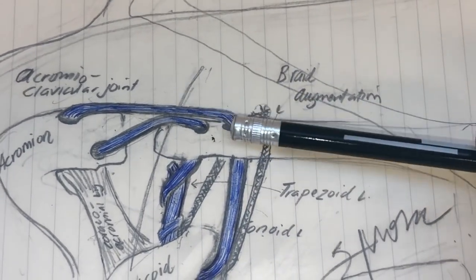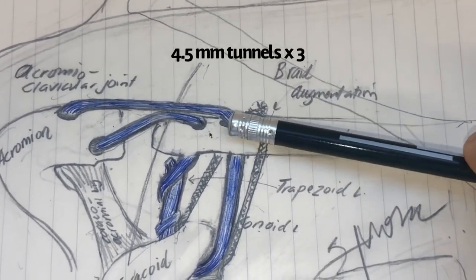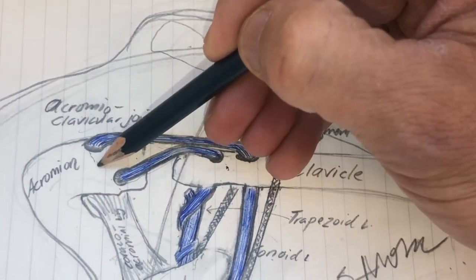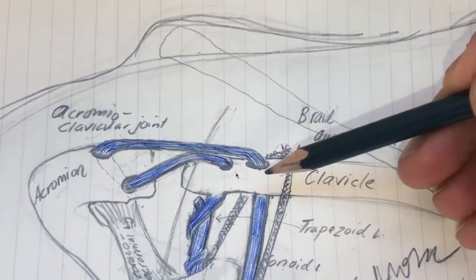Now before I actually do the braid, I've already drilled my conoid tunnel, trapezoid tunnel, and the acromial tunnel. So this one is sort of on a somewhat oblique like this. These are through and through.